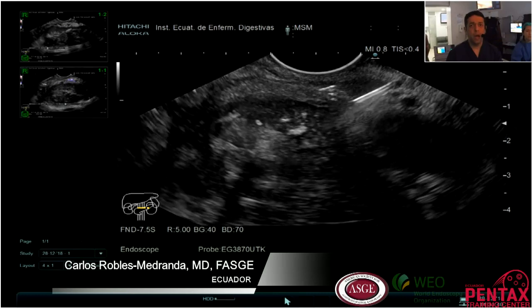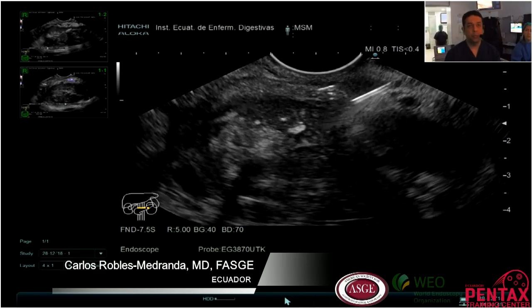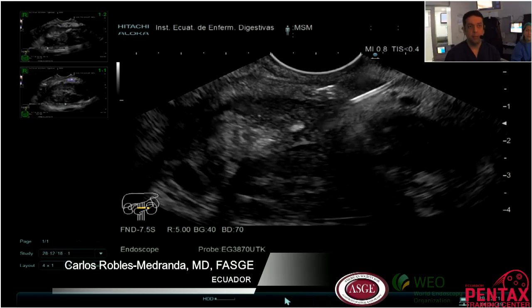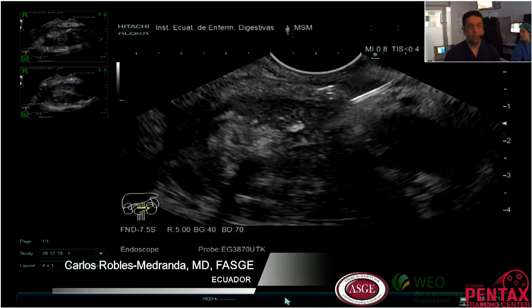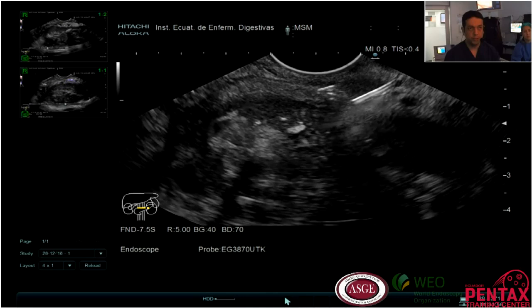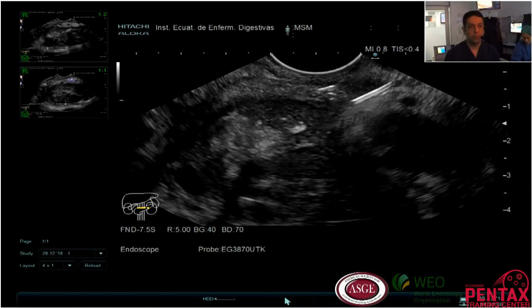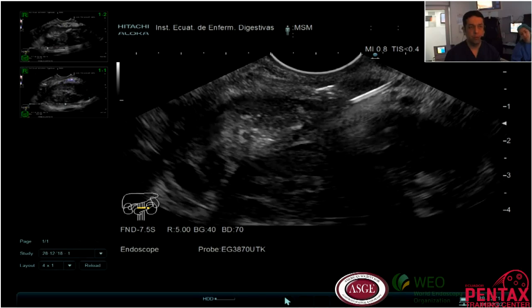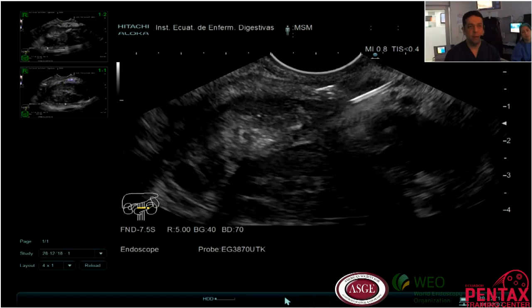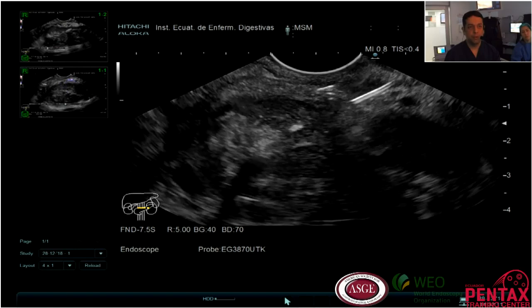So in my country we have just hot Axios with 15 millimeters of diameter and 10 millimeters of diameter. Now it's arriving for this year. We will show this new technology in May during a live course, and in August with the ASG live course, also online. The new Axios with different kinds of diameters, from 6 millimeters, 8 millimeters, and 20 millimeters.